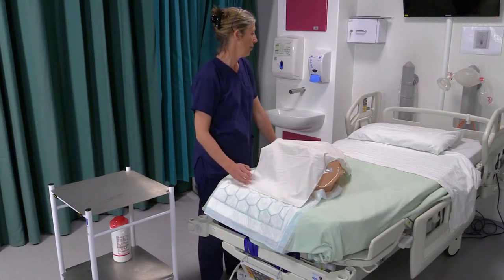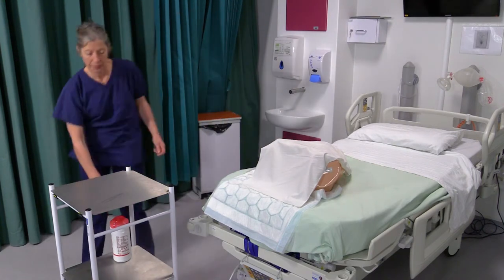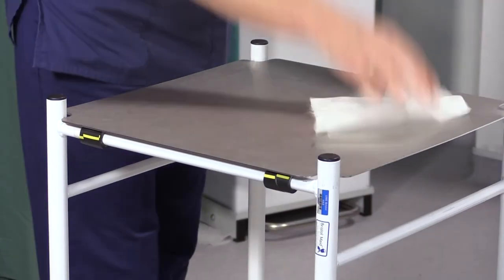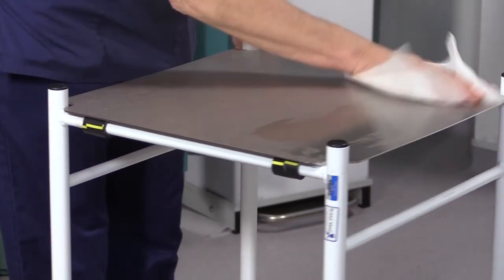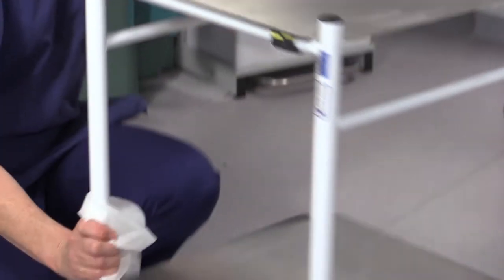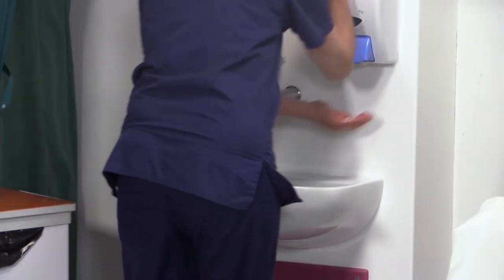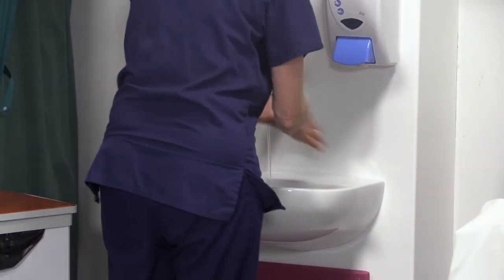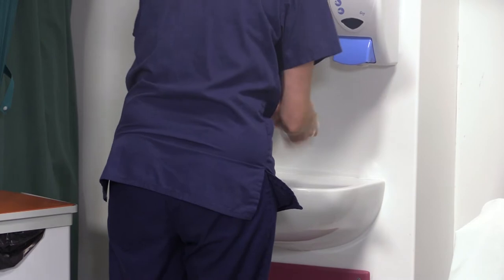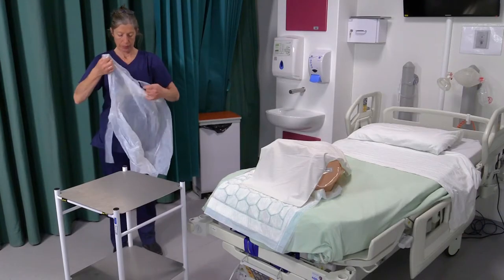Explain the procedure to the patient and gain consent. Clean your trolley with alcohol-based wipes from top to bottom, allowing the surfaces to dry. And now wash your hands. Put on your apron.